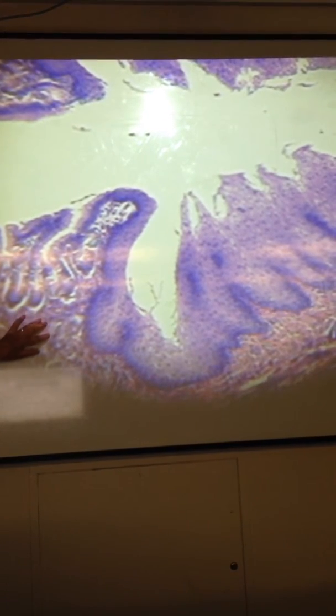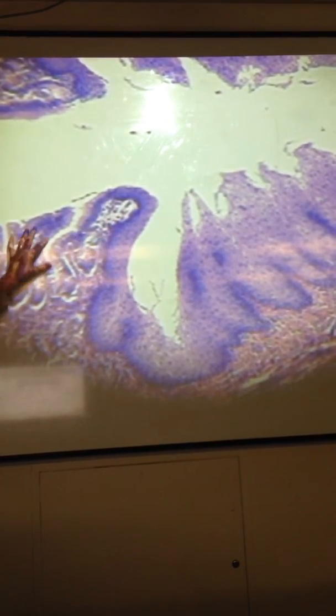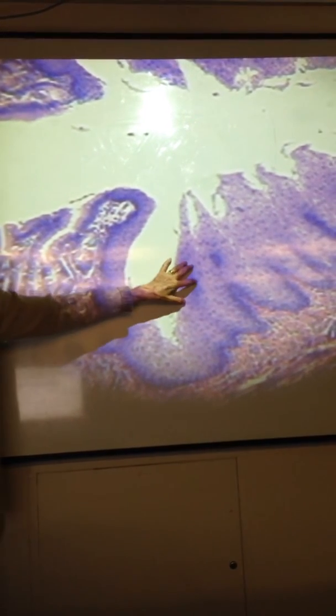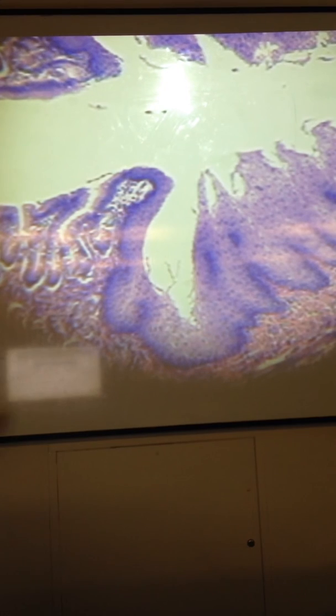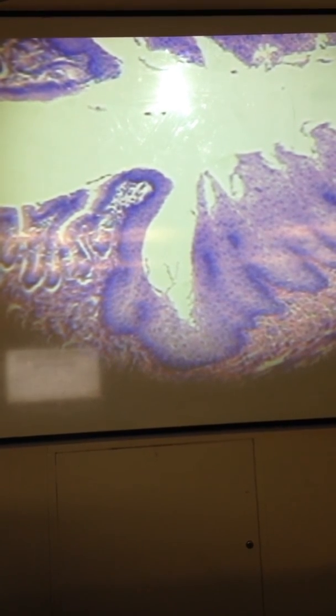This is lamina propria here. Lamina propria is way down here, but now we have the lamina propria here because we've gone from stratified to simple. And underneath the epithelial layer in a mucosa is a lamina propria. But it's different in the esophagus because of wear and tear as opposed to the stomach. Simple columnar. All right? Feel you're comfortable with that slide?